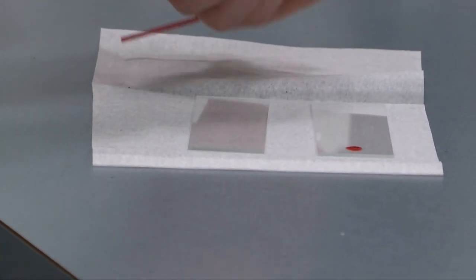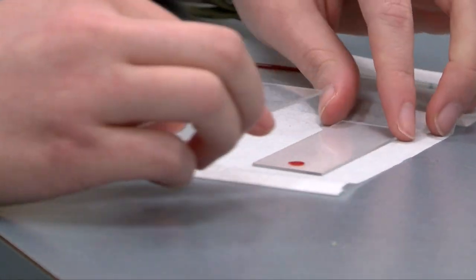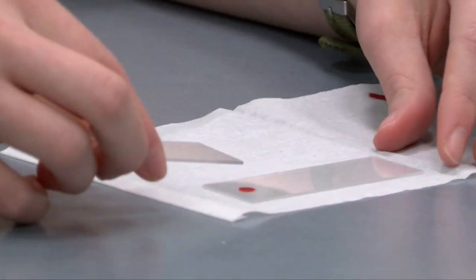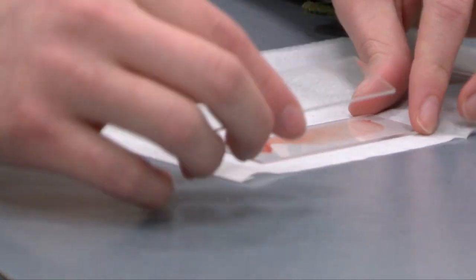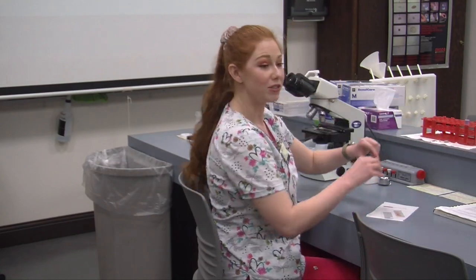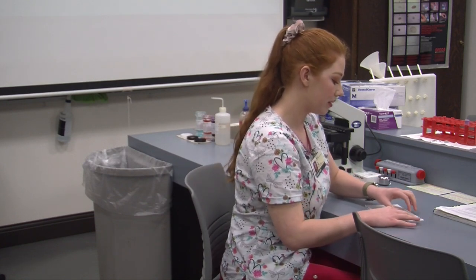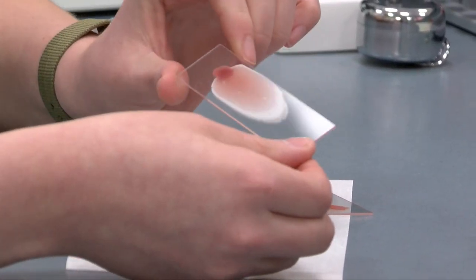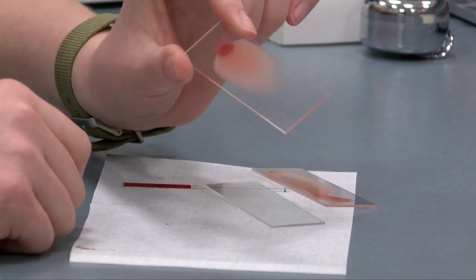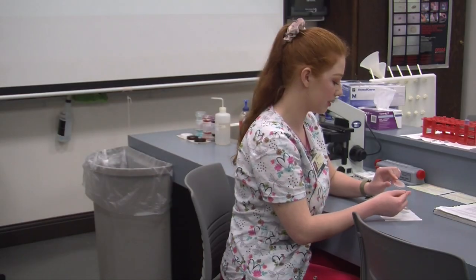I'll place a small drop of blood on my smear — just about that big. Then I'll take my other slide; this is the slide I want to have that angle with. I'm going to slowly draw back and then push forward. As you can see it didn't turn out quite how I want it. For demonstration purposes I pre-made a slide here. This is a pretty good slide — there are a couple holes but not too many in our monolayer. We have our feathered edge and our bullet shape, about one half of the length down the slide with a little room on the sides. So this is a pretty good smear.